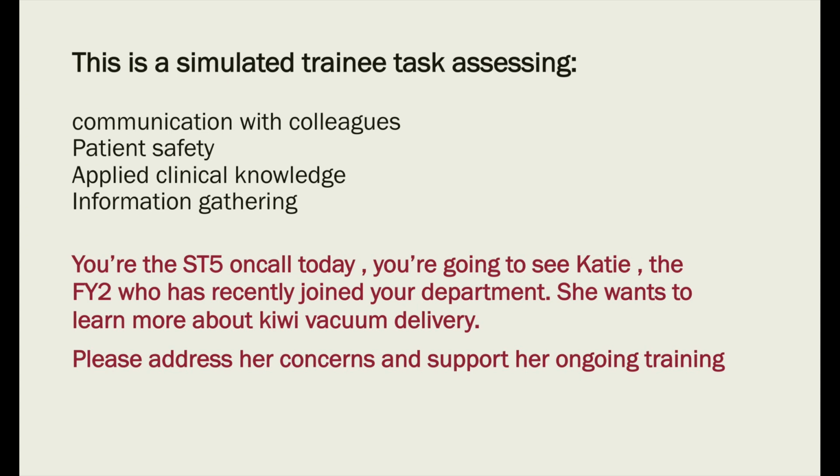Oh, that's brilliant. So you know some information about it. Today I'm going to tell you more details. We are going to speak about the indications, the contraindications, and I will show you how we do the procedure itself and the anticipated complications as well. I will tell you how to do the post-delivery care and how to document and debrief the patient. Do you have anything in particular apart from these items you want to discuss?